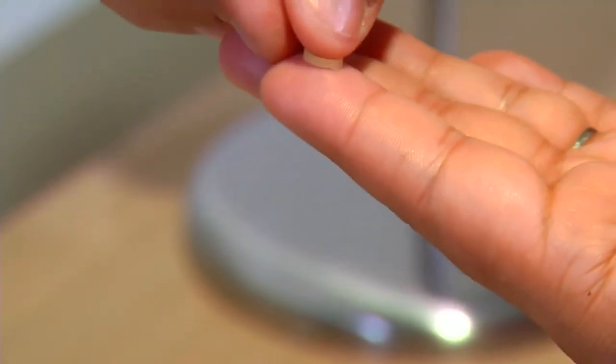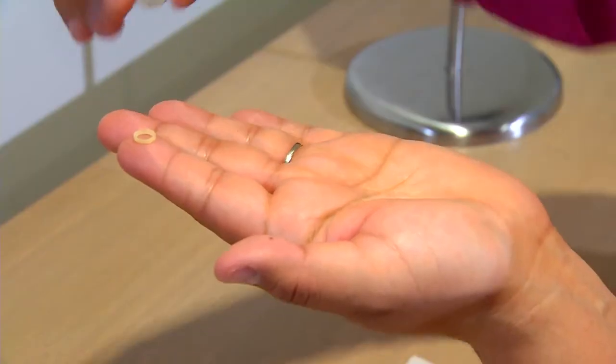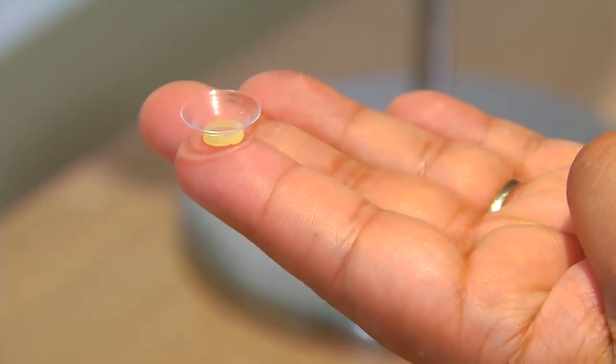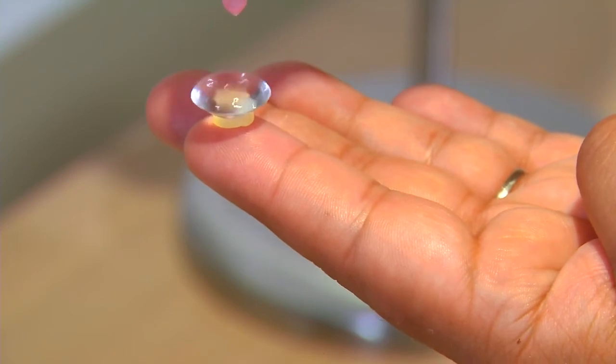If you don't have a suction cup, a small rubber band, like the ones used for orthodontic braces, can be placed on the tip of the finger to help keep the lens horizontal. Place the InSight Scleral Lens on top of the rubber band, make sure it's filled to the brim with solution, and apply it to the eye.